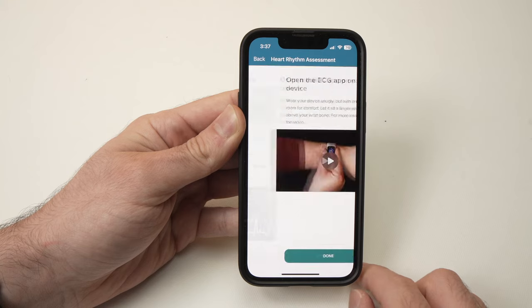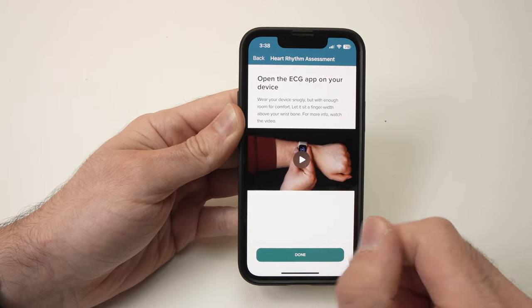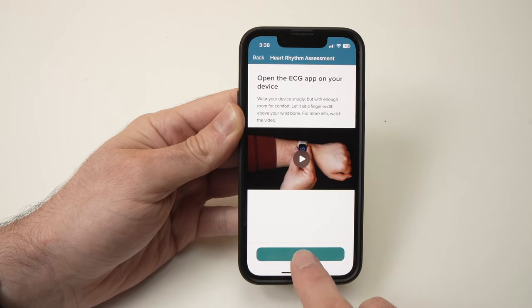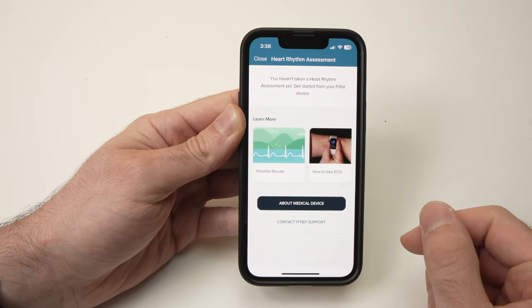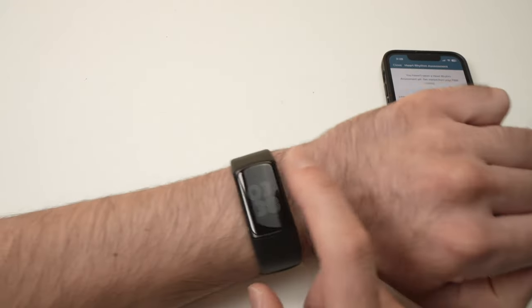Press Next and they'll give you a small video on how to position your fingers. Press Done once you've watched it. Now you can set the phone aside — we don't need it.